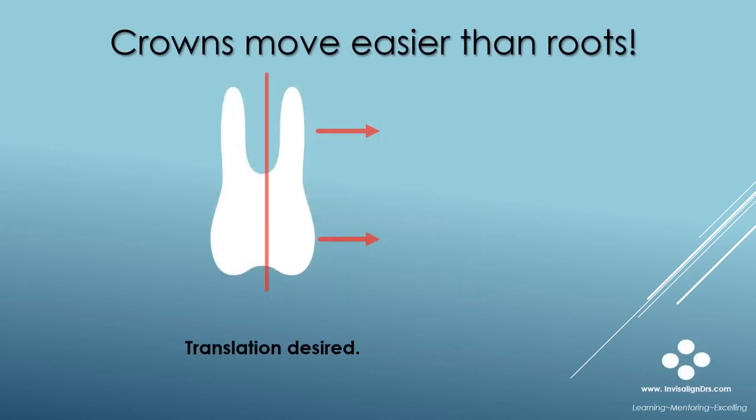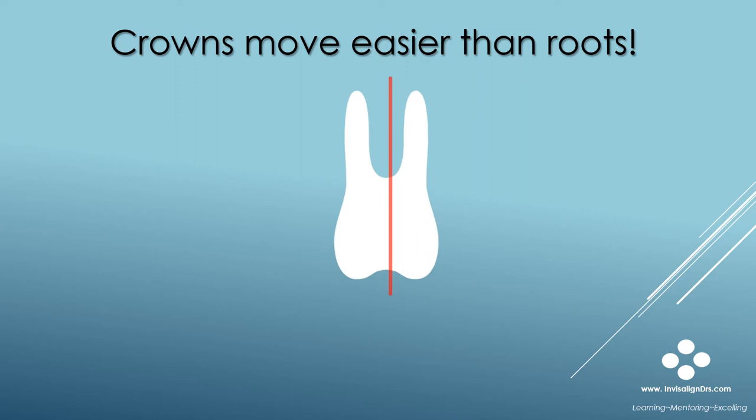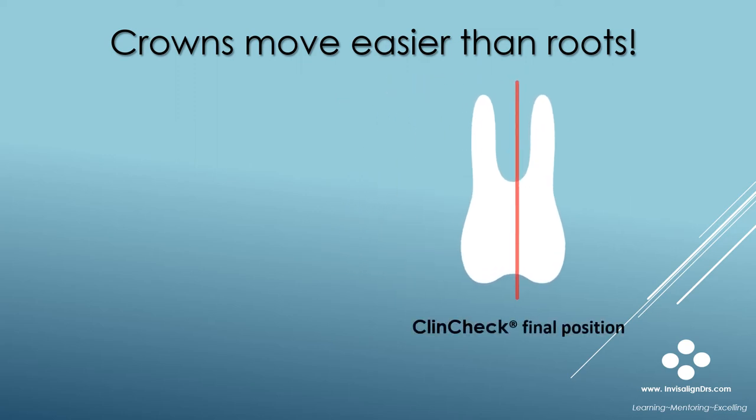Here's a situation where translation is programmed into ClinCheck for arch expansion. Note that both the crown and the root apices are moved together. The buccal-lingual inclination does not change. This represents the final position as seen in ClinCheck.